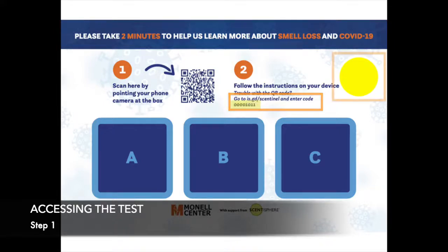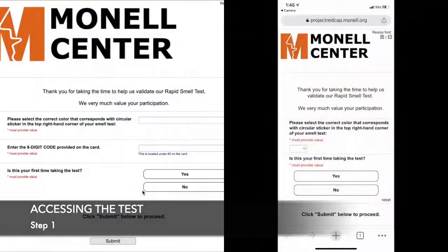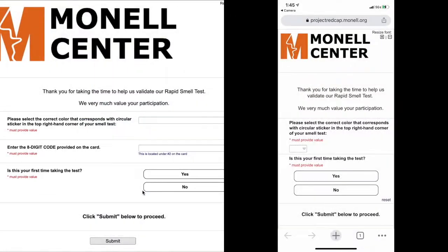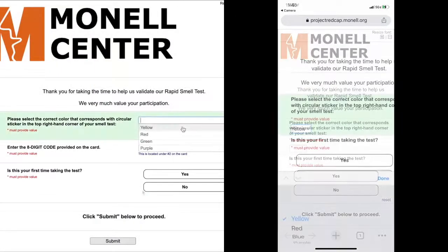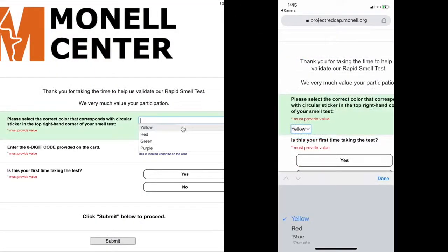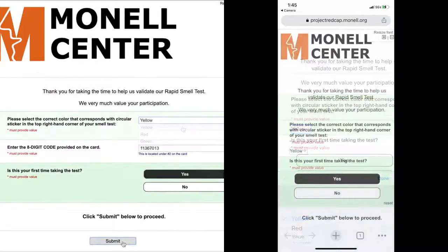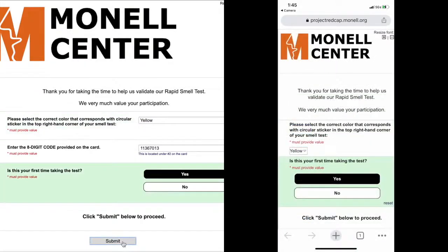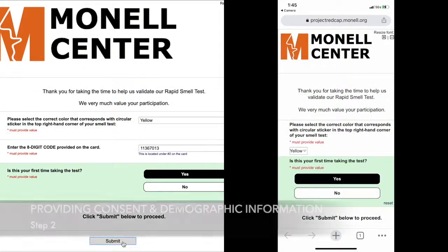Regardless of how you access the website, be mindful of which colored sticker is attached to your card. Once you are on the site, you will provide information about the colored sticker and the code on your card if you're on a laptop or desktop. Please let us know if this is your first time completing the test.